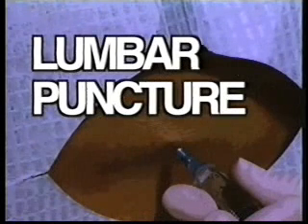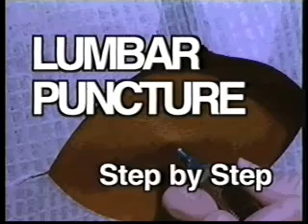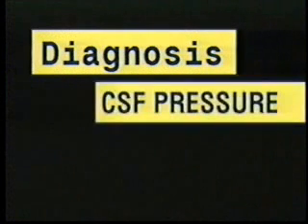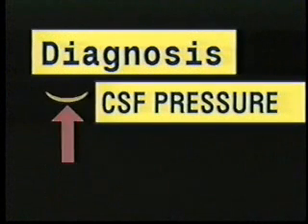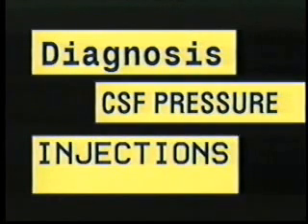The lumbar puncture is one of the easiest procedures to perform, but you must know the indications, risks, and possible complications. Diagnosis is the most common indication. Measuring cerebrospinal fluid pressure can be useful for determining the etiology of a headache. Injections are a third use, for myelograms, anesthesia, or intrathecal chemotherapy.